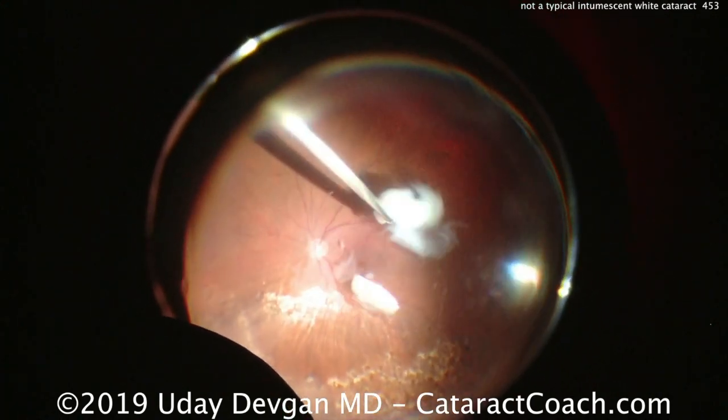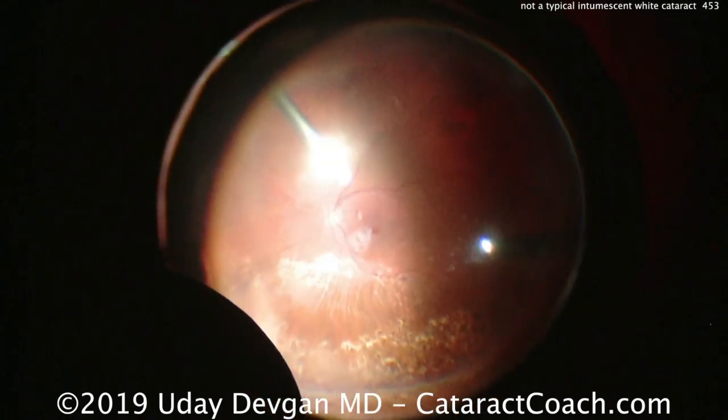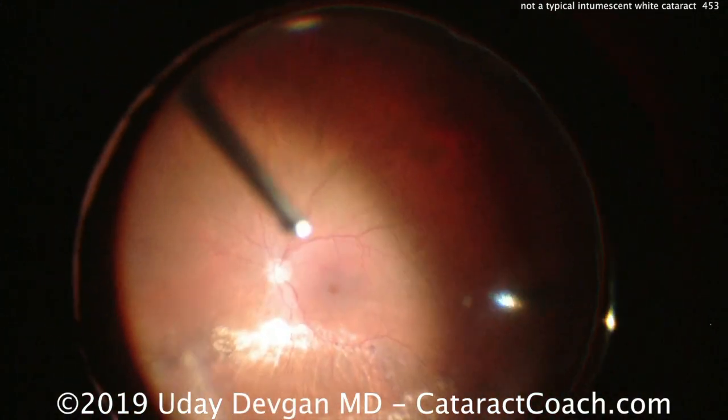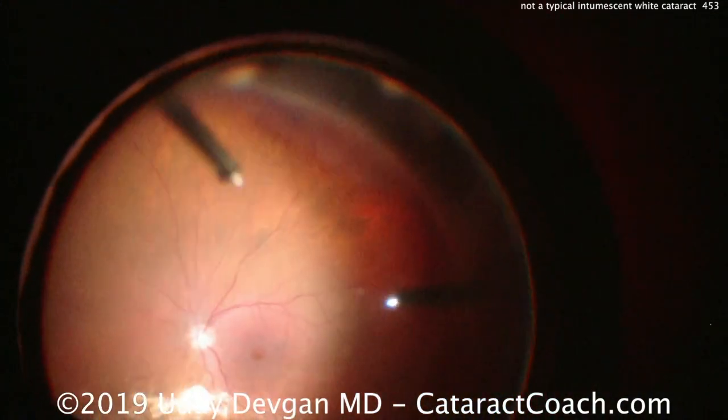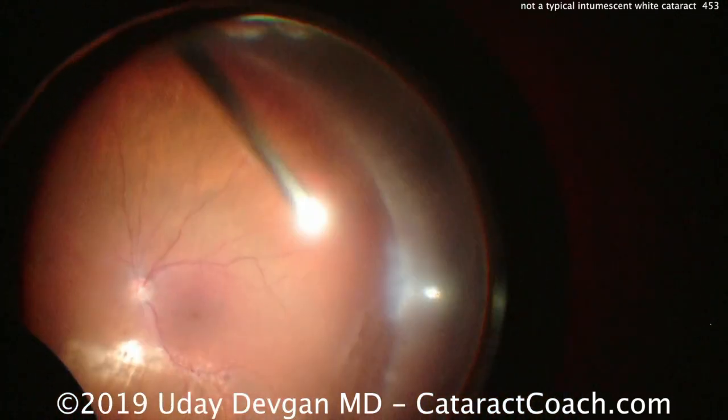And so there you can see the evidence of the prior detachment and the laser that was done before. And then the lens material came out very quickly and very easily. And that looks pretty good. Again, this is shot at very, very high speed, just so we can get through the case.